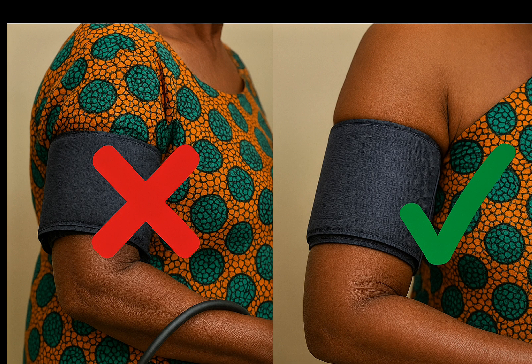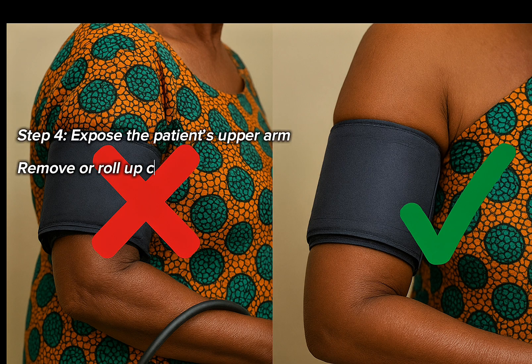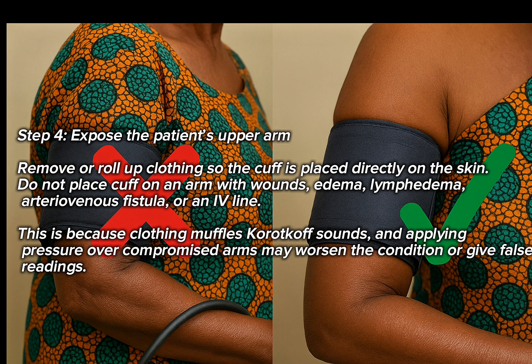Step 4: Expose the patient's upper arm. Remove or roll up clothing so the cuff is placed directly on the skin. Do not place the cuff on an arm with wounds, edema, lymphedema, arteriovenous fistula, or an IV line. This is because clothing muffles Korotkoff sounds, and applying pressure over a compromised arm may worsen the condition or give false readings.